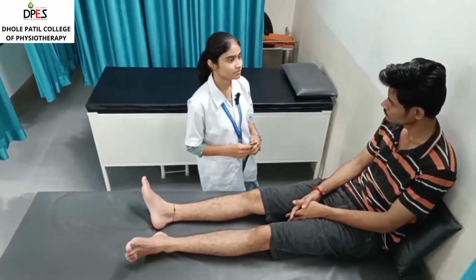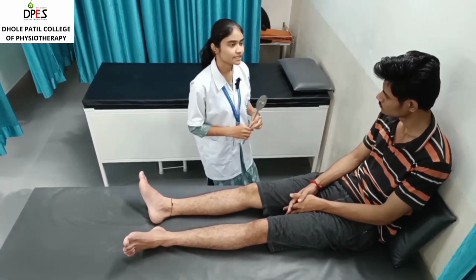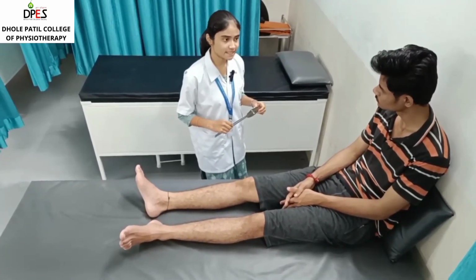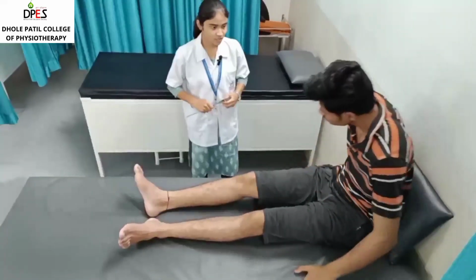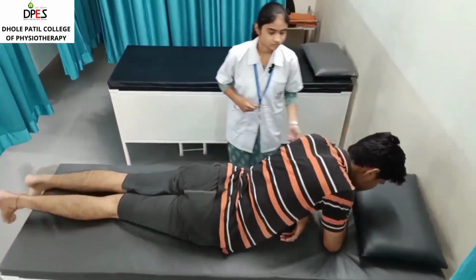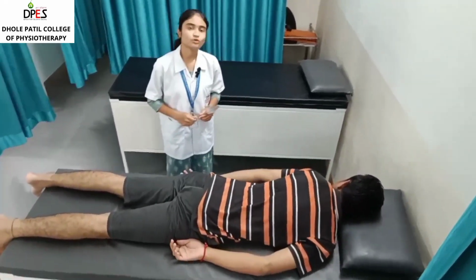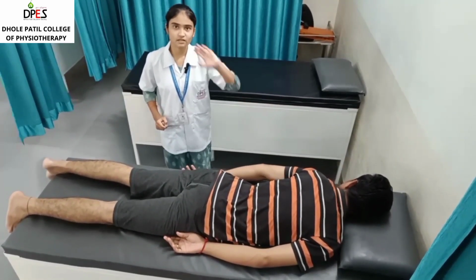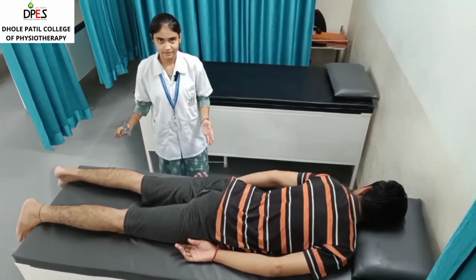Hello sir, today I'll be measuring your knee joint range of motion using the goniometer. We are using the universal 360 degree goniometer so that we can get the exact range of motion. So can you please lie down in prone position on your stomach? So I had given the relaxed prone position, as a pillow is given under the head to reduce his cervical lordosis, and the position is maintained.